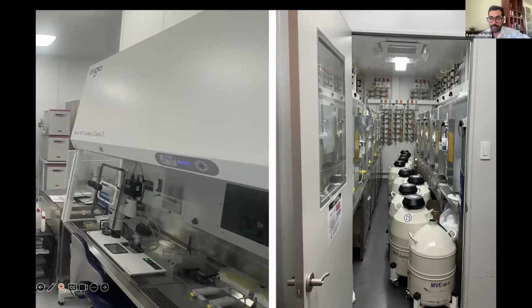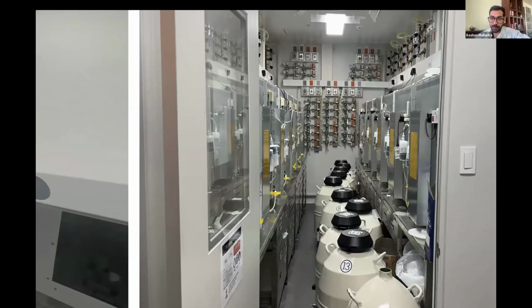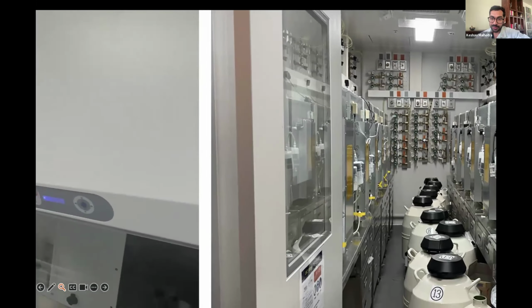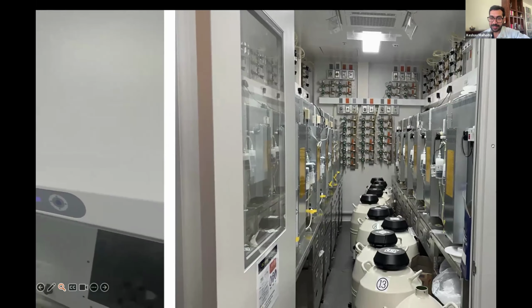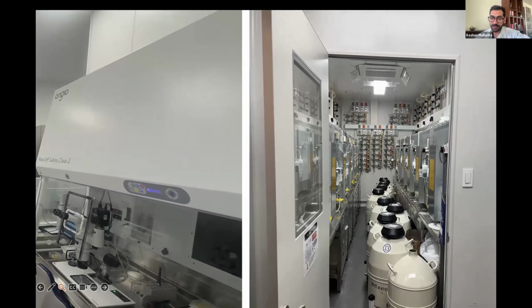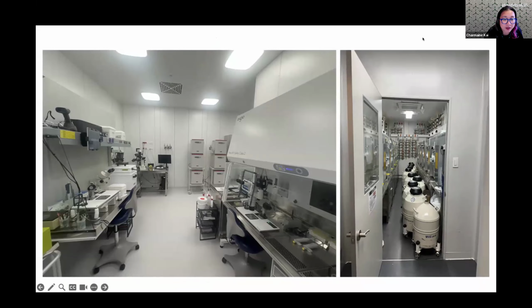If you can make out, all of the backs of the incubators are within this room, and all of the gas supply regulators, everything is within this room. So you just need to enter this room to change the filters, or do whatever you want. All the service and maintenance happens here, and it is connected to two different laboratories within the same unit. That's really good because it means people servicing it don't need to enter the lab at all. It was a fantastic experience visiting. This is Cha Hospital in Korea.